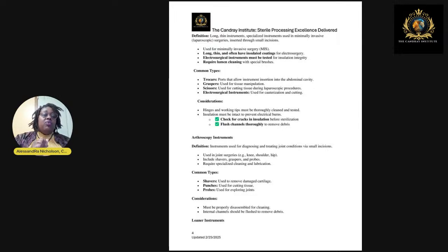You could think about how big a rongeur needs to be for something like an ortho procedure, where I'm doing surgery on this big bone up here. Well, all of these tiny ones, we're talking microscopic instruments, 2 millimeter, 3 millimeter instruments.